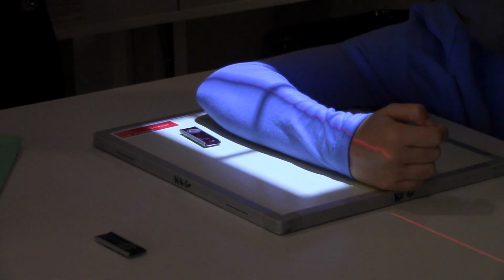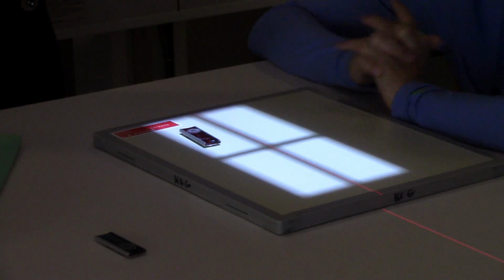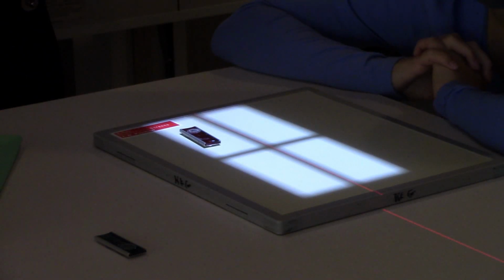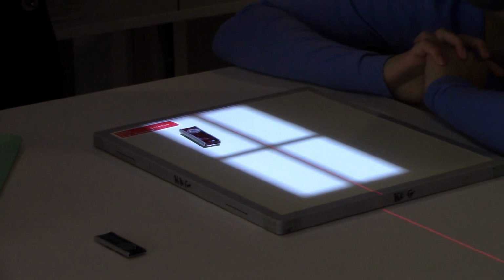This is actually one of my favorite. When I see forearm x-ray on a requisition, I'm like, yes, because it's just like, you know, 1, 2, back to your room. It's pretty easy.